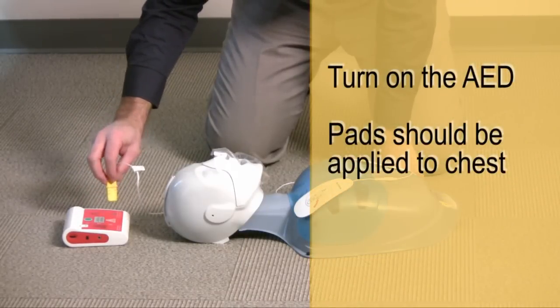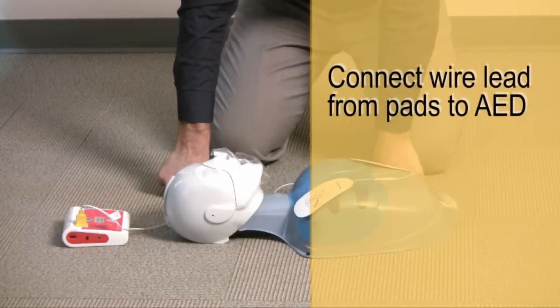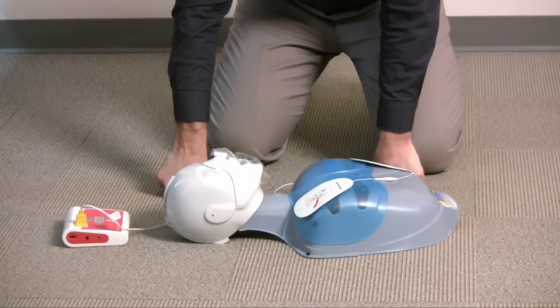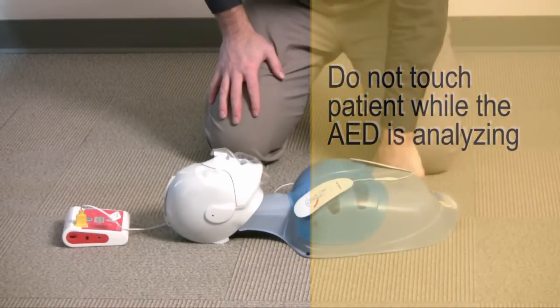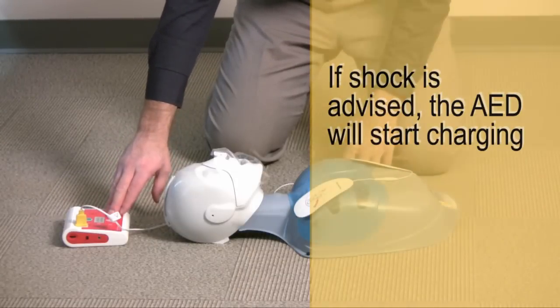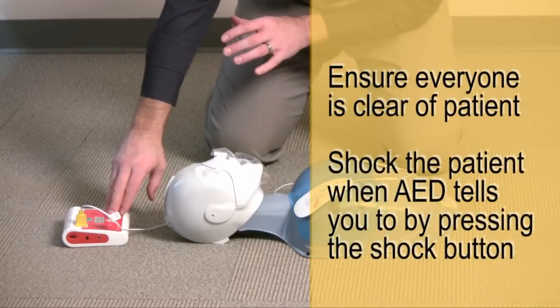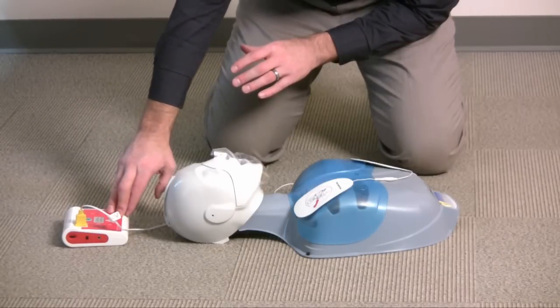Apply pads to patient's bare chest. Plug in pads connector next to flashing light. Analyzing heart rhythm. Do not touch the patient. I'm clear, you're clear, everyone clear? Shock advised. Charging. Stay clear of patient. Okay. So getting ready to shock, everyone clear? I'm clear. Shock now. Press the orange button now. Shock delivered.